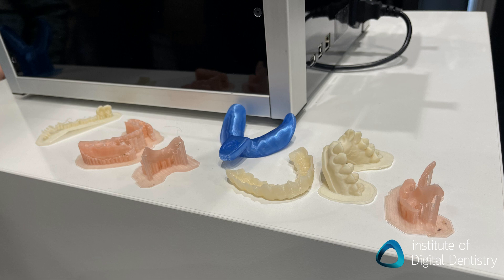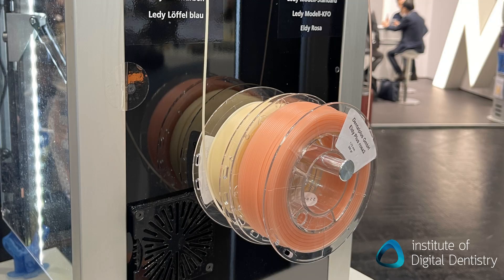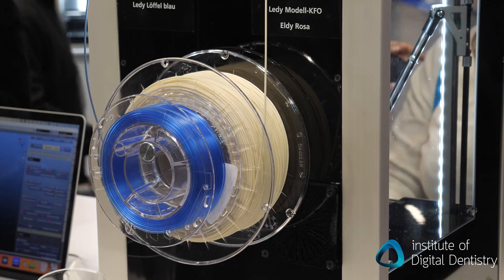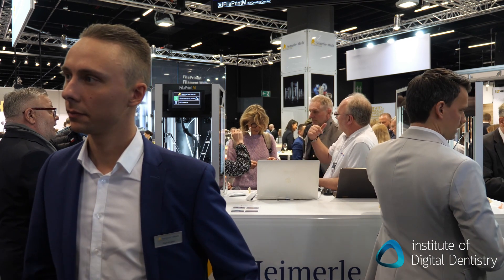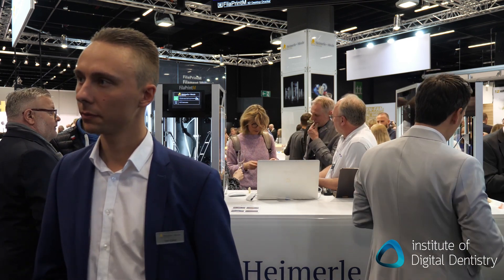One of the unique things about this printer is it's got dual filament — multiple colors for different applications. Why is that? We have our pink material and our tooth color material for partial dentures, for example. Our blue material for trays is certified to be in contact with the patient's mouth. And our white material is for casts. So if I'm printing a denture, can I print both the denture and the teeth at once? Not at the same time.